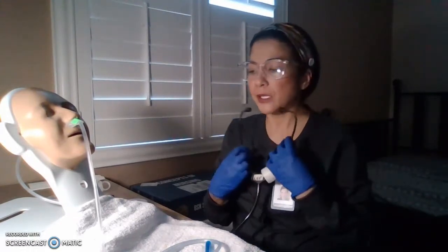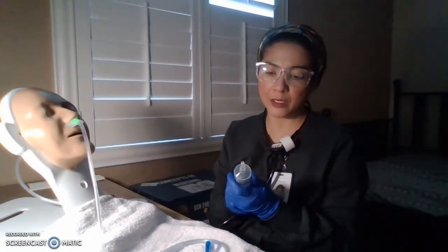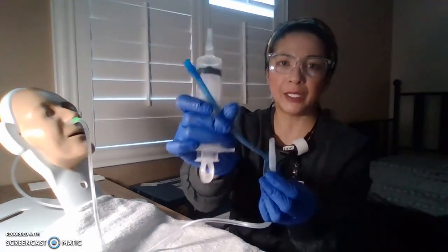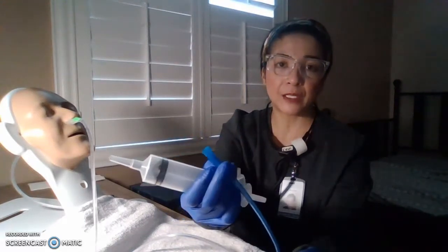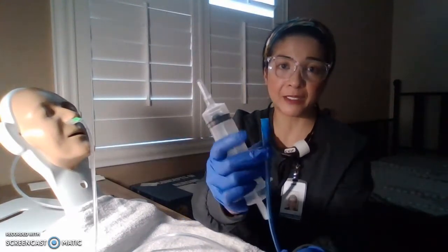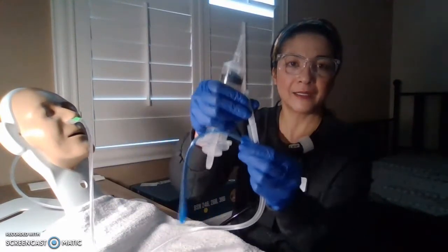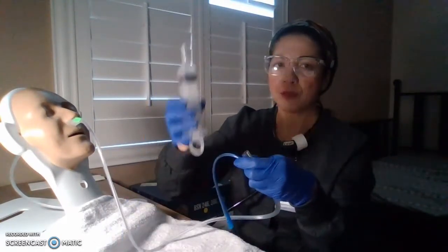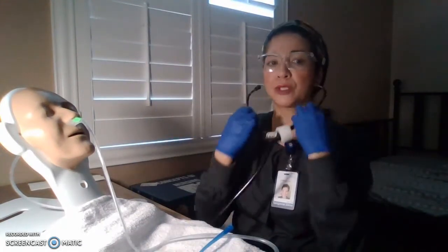All right. So we are going to get our 60 cc syringe and we're just going to draw probably 10 to 20 cc's of air. And also, oh yes, by the way, there are 2 endings over here. The blue one, we're not going to use that. Usually an anti-reflux valve is placed over here to prevent any gastric contents from leaking out. And this side is what we're going to use, okay, for feeding and aspirating. So air in here, and we are going to listen for that whooshing sound.